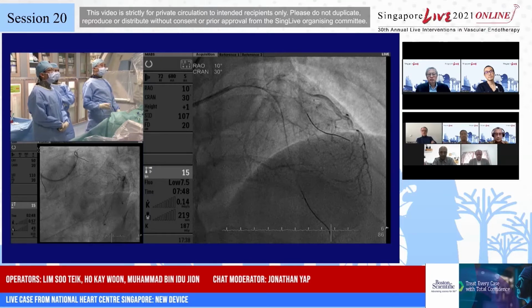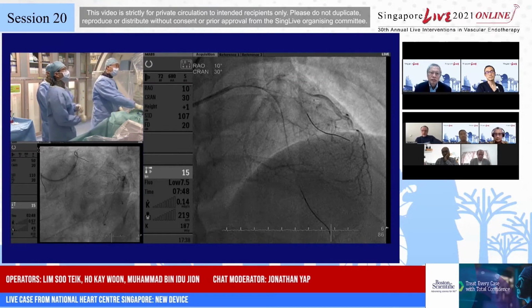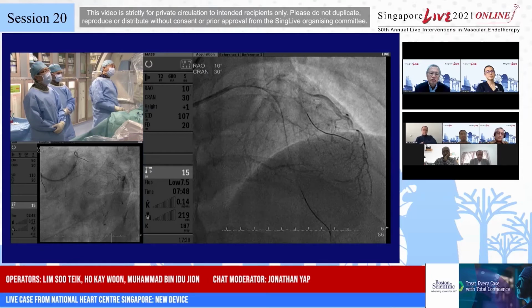The 2.25, 2.5, 2.75, and 3 can all go up to 4 millimeter according to the bench testing. So that is a concern. At 38 there's a little bit of concern about the polymer when we want to do that.